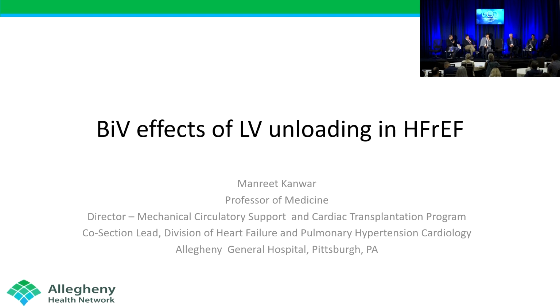With LVADs, there's probably some degree of RV harm that happens with a traditional full sternotomy LVAD as opposed to a minimally invasive lateral thoracotomy approach that spares the pericardium. I know Ryan Tedford put out a nice paper showing that, with single beat PV loop assessments as well, that if you do the minimally invasive lateral approach and preserve the pericardium, you get less RV failure post-LVAD.